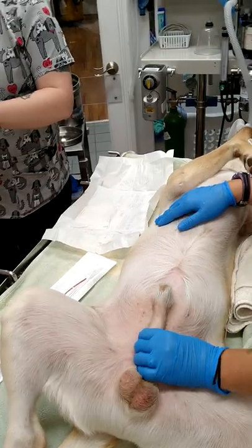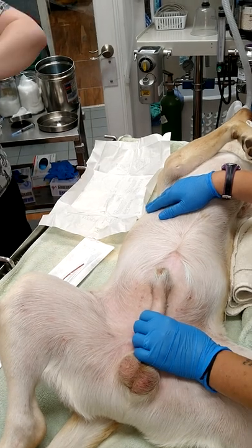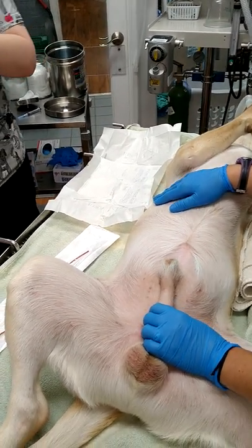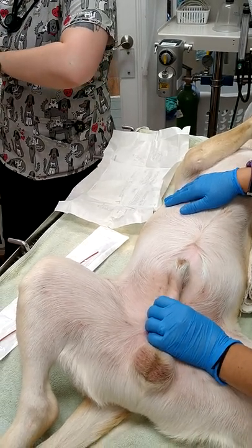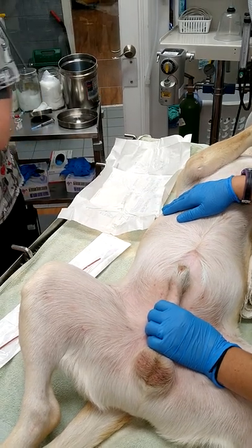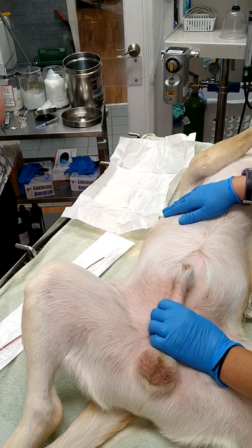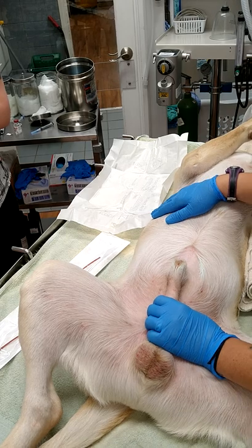But now, since you have your sterile side on your sterile side, you can kind of nudge your fingers down, and that way you're not having to sit there and caterpillar curl. This is going to be the whole thing — just me trying to get these gloves on. As long as those are comfortable, those are fine for putting in your cath — it's not like you're going into surgery.